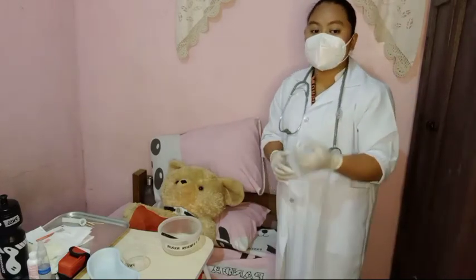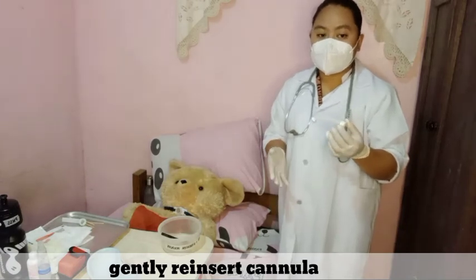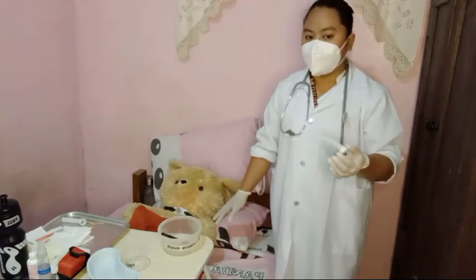And then, gently reinsert the tracheostomy tube back to its original place. Be sure that it is properly locked.